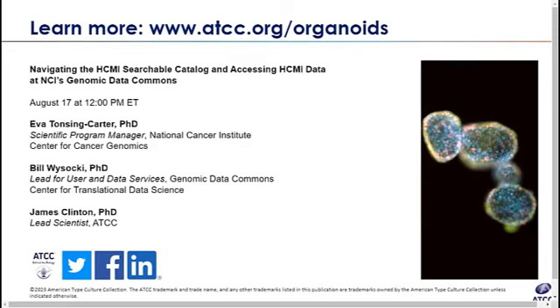Yes, I can answer that. The kits are not all of the components you need to make the complete media. All of our kits use advanced DMEM and other things like B27 and so forth, everything in L-glutamine. Those are reagents that are in larger volumes, like 10 mils, 5 mils, things of that nature. And those reagents are listed on the protocols for each model on the website.